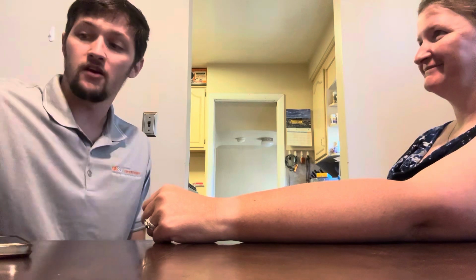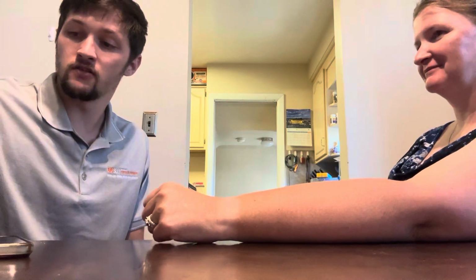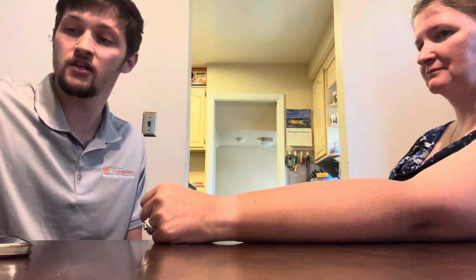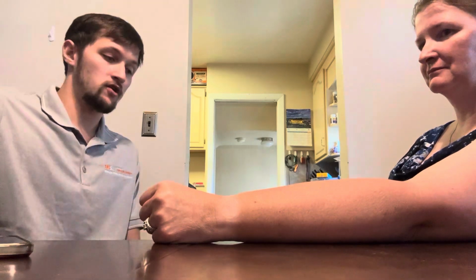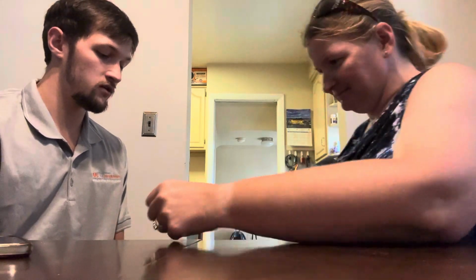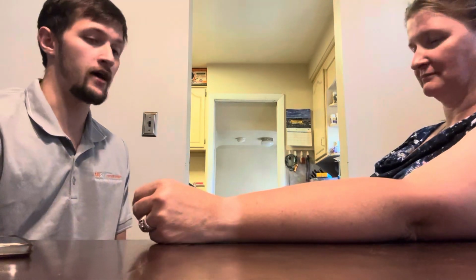I have my mock patient here, my mom. And today we're going to be doing 4 tests: the pulse test, the blood pressure test, the oxygen saturation test, and the respiration rate test. Before that, I'm going to have you just be positioned in the chair with your back supported and your legs uncrossed and on the ground flat.